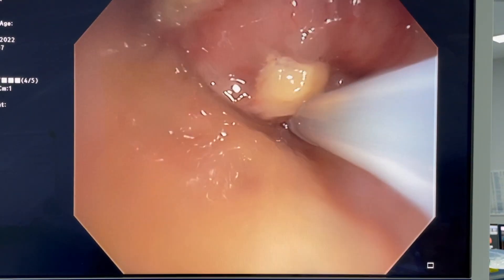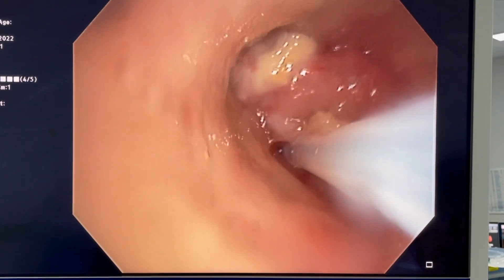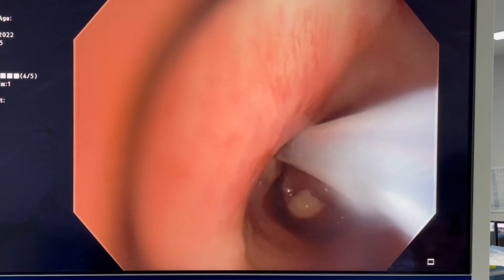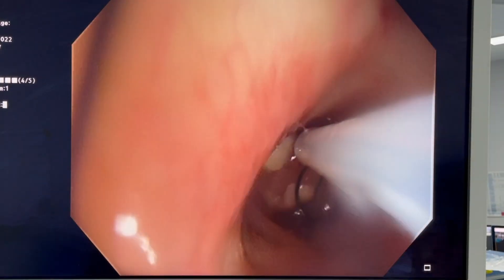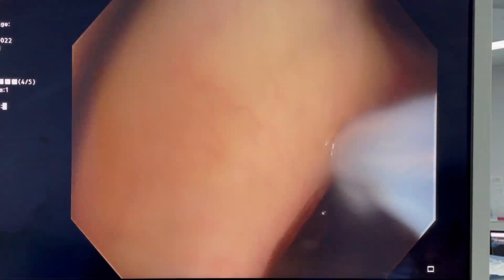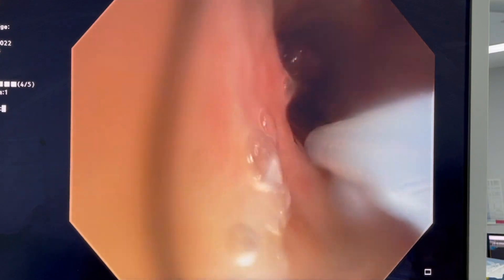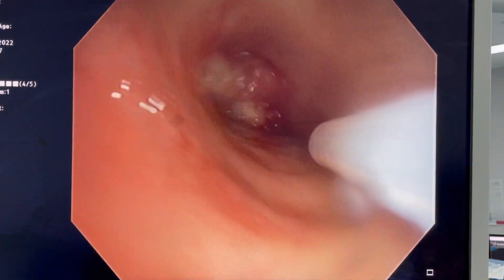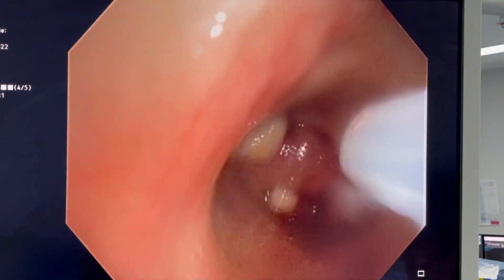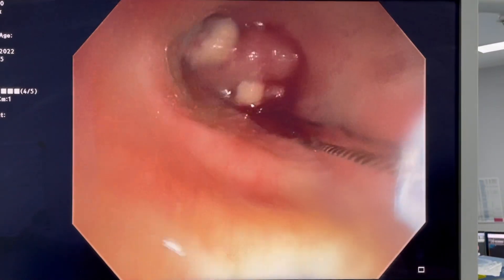Here I'm going to use an electrocautery diathermy loop. I'm going to loop it around the endobronchial component of the tumour to try and snare it off. Once I can get that loop around a lot of the tumour, I'll then be able to apply an electrical current to cut through it, which will also coagulate at the same time. It's a nice technique to resect endobronchial tumours, which can be quite vascular.